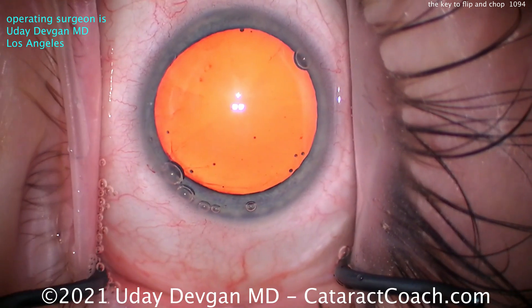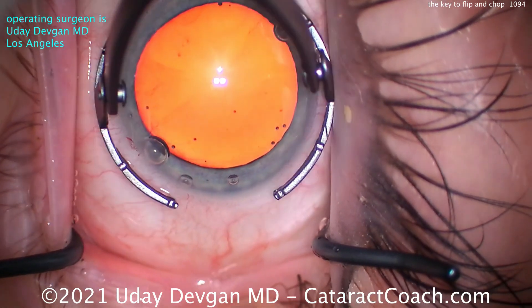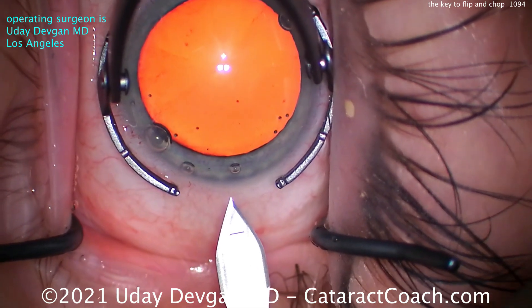Here goes our dispersive viscoelastic — getting that capsule or bag distended and flattened. That anterior capsule should be flat.